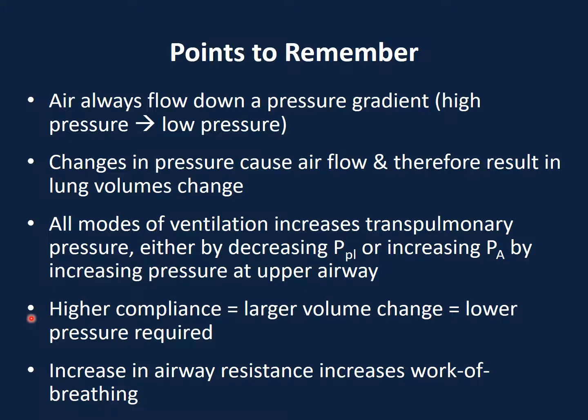The two concepts of lung characteristics are compliance and airway resistance. High compliance means it's easier for the lungs to distend. Low compliance means the lung is getting stiffer, so it's harder for the lungs to distend, and therefore a higher pressure is required to distend the lungs.